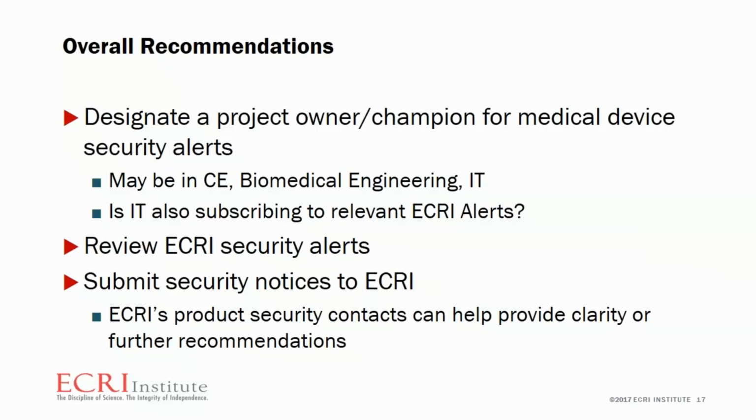Overall, in light of these new security alerts, we recommend you have a responsible person within your organization who focuses on them, whether it's biomedical engineering or IT. We recommend you periodically review the security alerts, and if you're getting confusing security alerts, especially from your medical device manufacturers, do report them to ECRI. We can assign resources on our behalf to investigate the matter, reach out to our product security contacts, and see if additional clarification is merited.